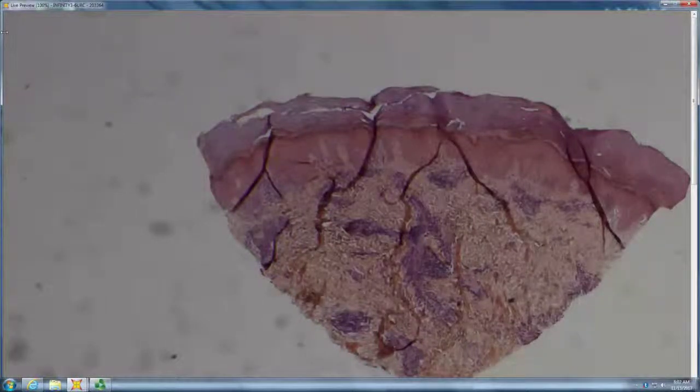That's a lot of lymphs. Yeah, lots of lymphs, lots of histiocytes, lots of necrosis. I'm not sure why this is in this box. That is a big caseous thing that looks like it should be mycobacterial, right? So that belongs in the granuloma box. Someone's been sloppy about what they've been doing, and that belongs in a different box.